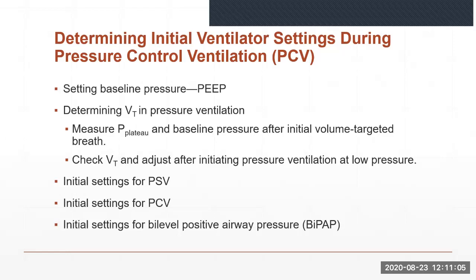It must be adjusted as necessary to achieve tidal volume. If plateau is not available, the peak pressure from VC-CMV minus 5 centimeters of water pressure can be used as a starting point. If volume readings are not available, an initial pressure of 10 to 15 centimeters of water pressure with simultaneous volume measurement and adjustment is appropriate.